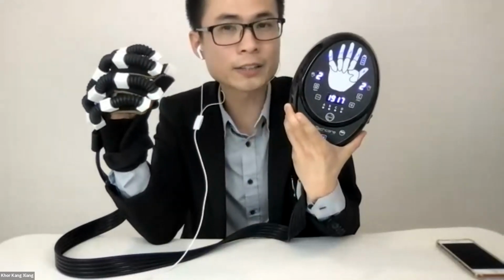So this is the first thing we will do for most patients. A lot of patients ask how they should train. By the way, we do have therapists to train them directly if they have the device. And most importantly, start with something simple first, because this is a very customizable device. We have therapists using it, we have patients using it as well. The first thing is to start something simple, allowing our brain to accept simple movement. The first thing is to train the 5-finger opening and closing movement. Very simple. Then slowly after 1 to 2 weeks, they can start to relearn the movement. Only then can we start adding different kinds of movement on the fingers.